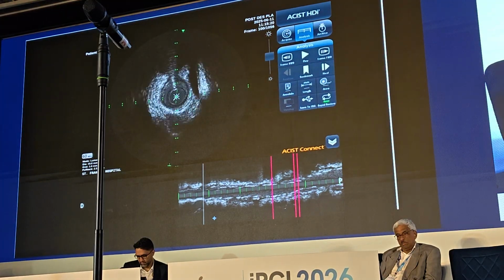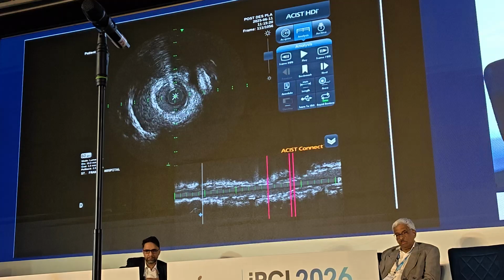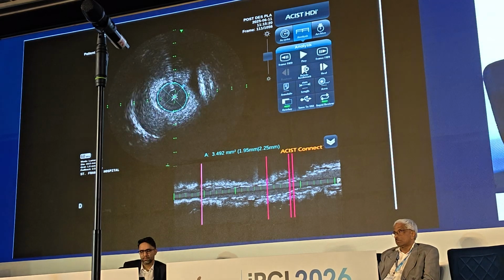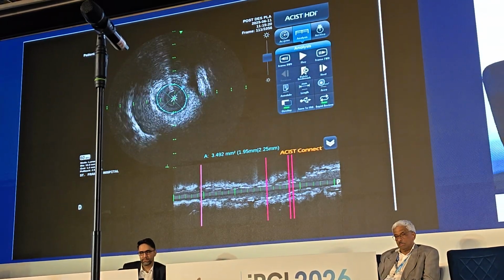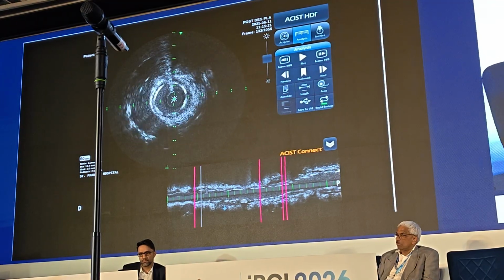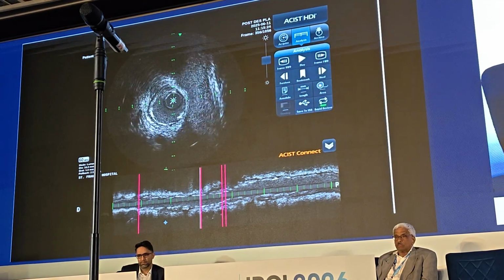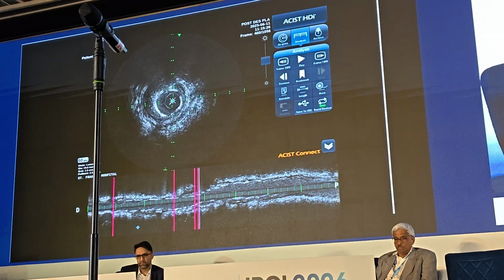Most of the stent, the proximal and distal portion of the stent, is very well expanded. But that one mid portion does have under-expansion, and that's not that surprising because we post-dilated the proximal portion, proximal to the bifurcation. We never post-dilated this region. So it's helpful. It tells us we need to go in and post-dilate very focally there. What's also nice, the IVUS shows we don't need to post-dilate at the edges, so there's no risk of an edge dissection this way. And we're doing targeted therapy exactly where you need post-dilatation, as opposed to just indiscriminately doing post-dilatation.